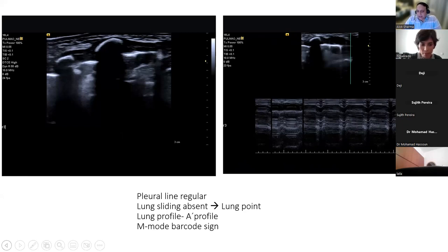And I think Mayank's thoughts, I mean, if you've had in utero aspiration, it could be the case, but we don't have any history. Experiences of in utero aspiration usually have nail staining, cord staining, but yeah, it would fit into MAS, but we've got TTN. So we've got a mix of features here.